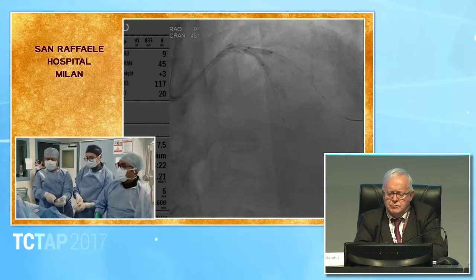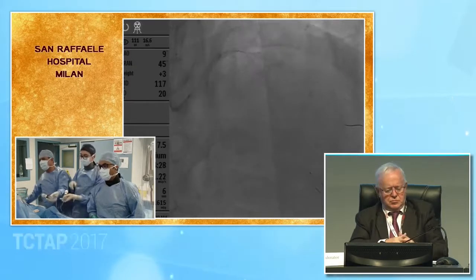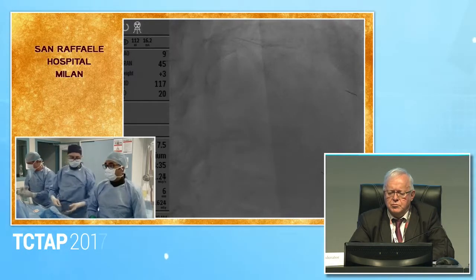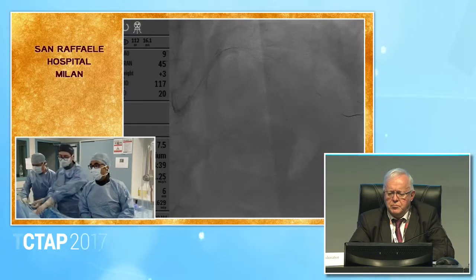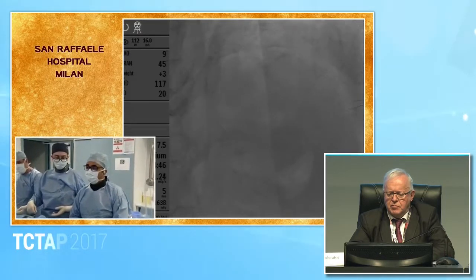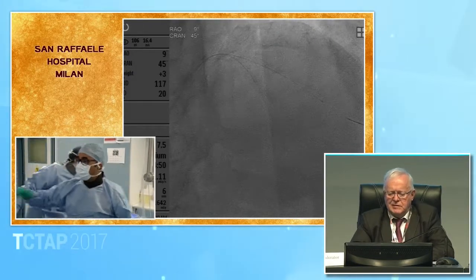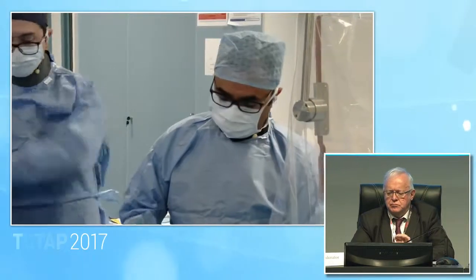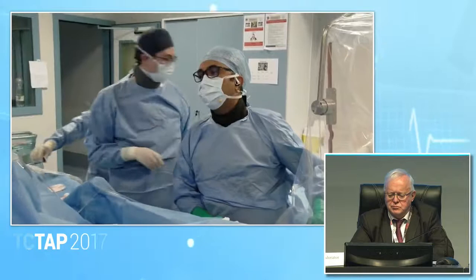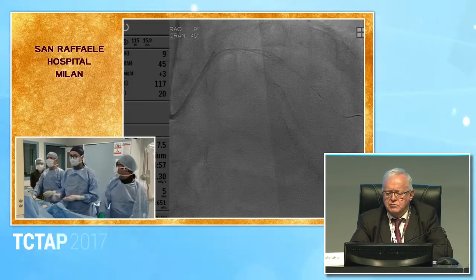Okay, negative. So we'll take these balloons out, we give a little bit of nitro, and I show you an angio, and we can make a decision about the LAD, whether you think IVUS will help, or I think we have a couple of different things we can do. We can maybe do drug-coated balloon, or we can do a long stent from the proximal LAD to after the second diagonal, and then recross and essentially do two culottes with one stent in the main branch. Okay, some nitro, please. Okay. Flush the nitro. Perfect. So I give you an angio now.